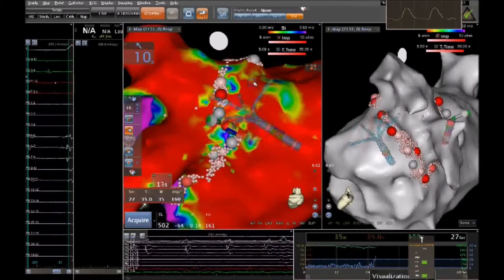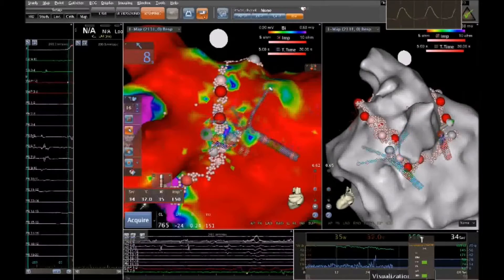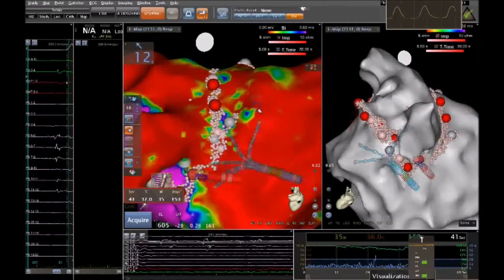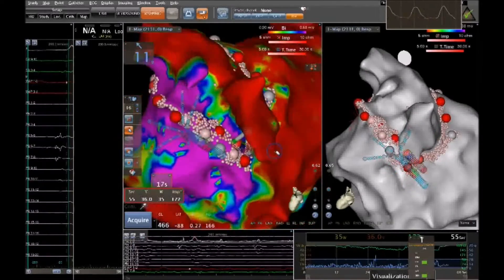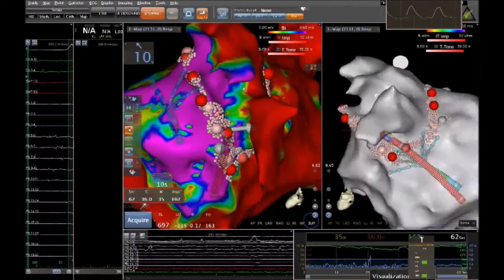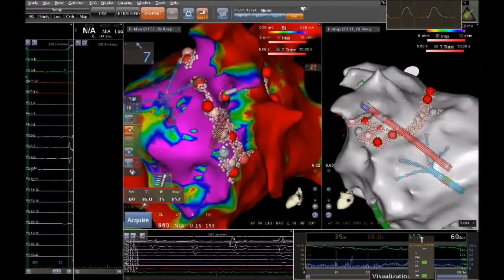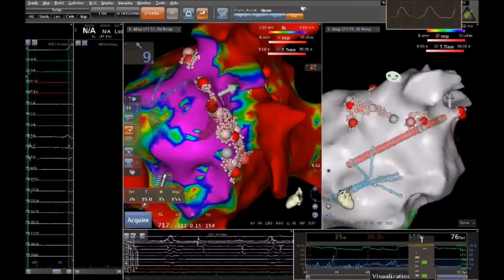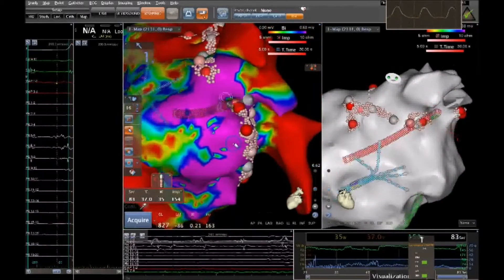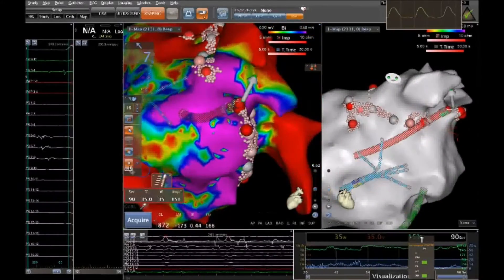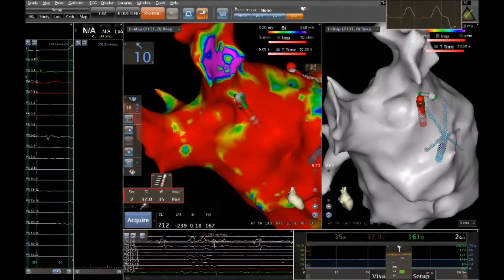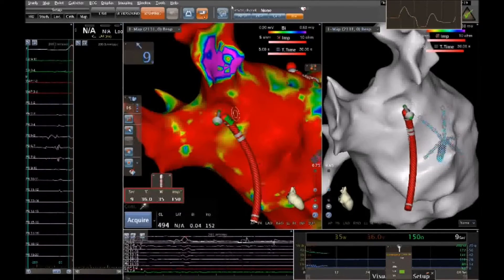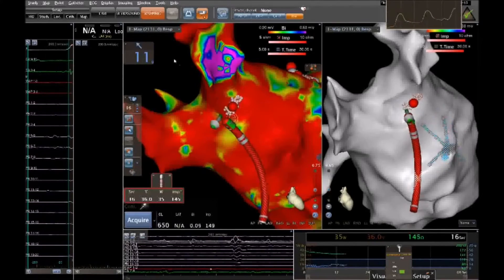Once the ablation is completed around all four pulmonary veins, the 3D mapping procedure will be repeated to ensure that all abnormal electrical signals were targeted and that the veins are electrically disconnected from the left atrium.